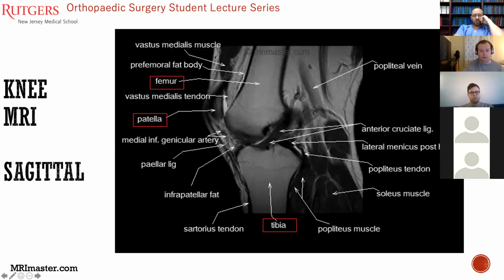As you get to the middle aspect of the knee, again, keep orienting yourself with the femur and the tibia. We're more medial, so we don't have the fibula in view anymore. But you can start to see these vertical strands of the ACL. As you move a little bit more medially, you'll start to see fibers of the PCL coming in posteriorly that take a little bit more of a roundabout course from the femur to the tibia, as opposed to these straight vertical fibers that you'll see in the ACL.